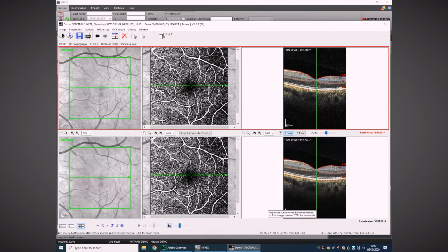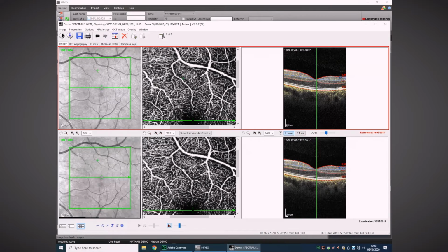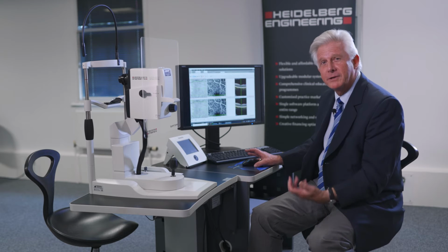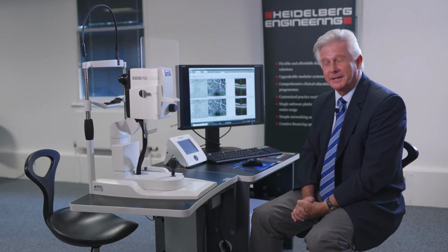And that tells us that we're actually measuring physiology. The body is constantly changing throughout the day. And so when you sample at one particular moment, you might get a different pattern of OCT angiography compared to another, and both are normal, but they're different. So just to make the point, when we're measuring OCT angiography, we're measuring physiology of the body. It's not OCT and it's not FA.